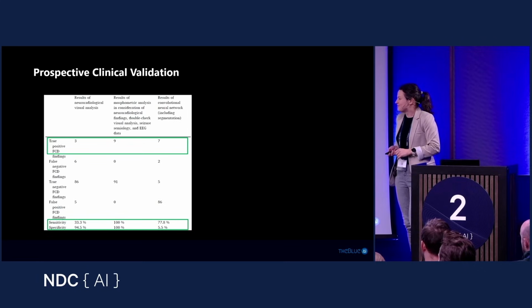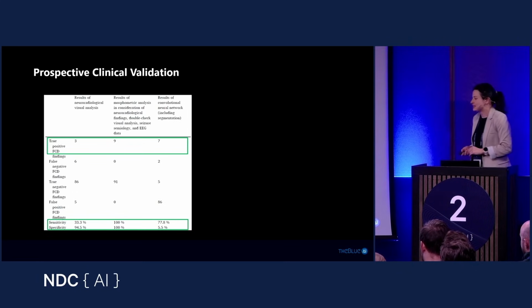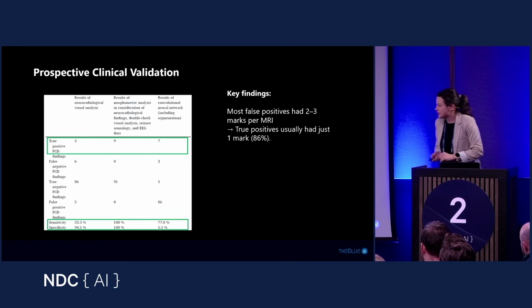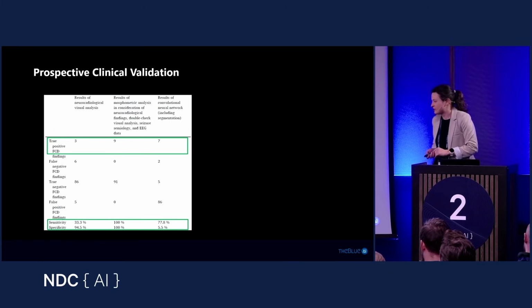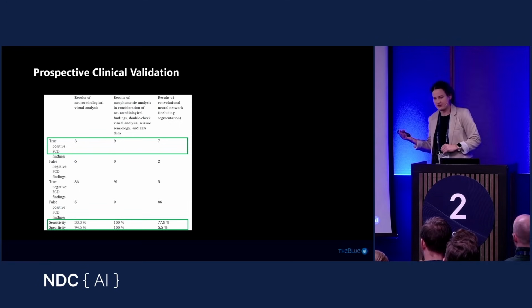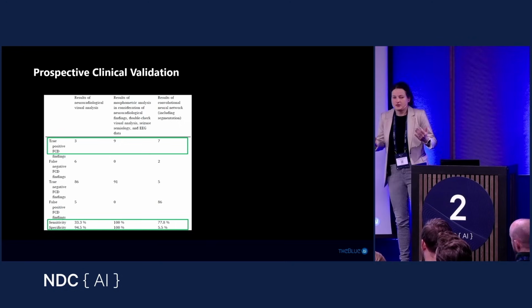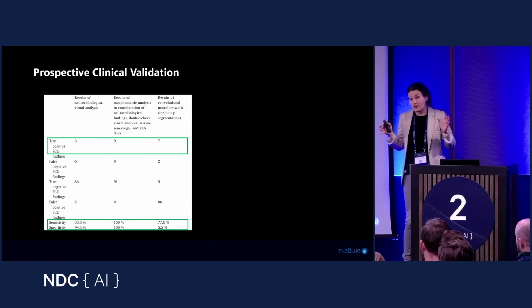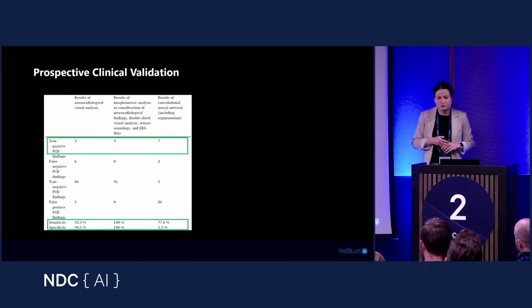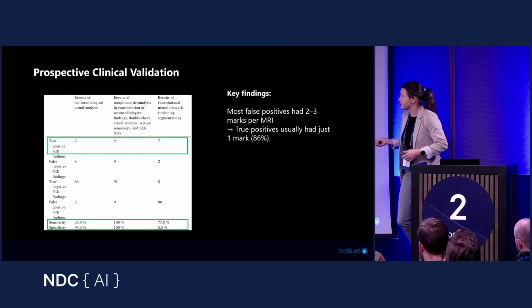But then we also have taken a look at the different things that we can see here, which is that we had the specificity of 5.5%, meaning that our model was very frequently saying that there is an FCD, even when there wasn't. So I wanted to understand what happened. And I really encourage you, every time you work on machine learning projects, really try to understand why did the model behave in this way.